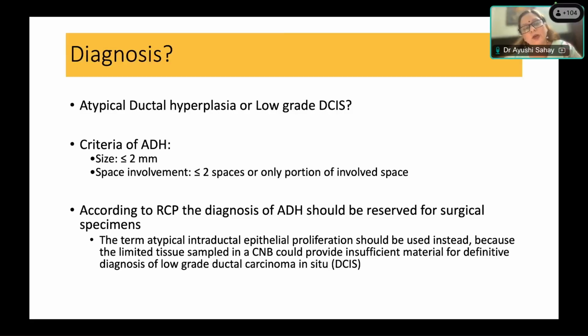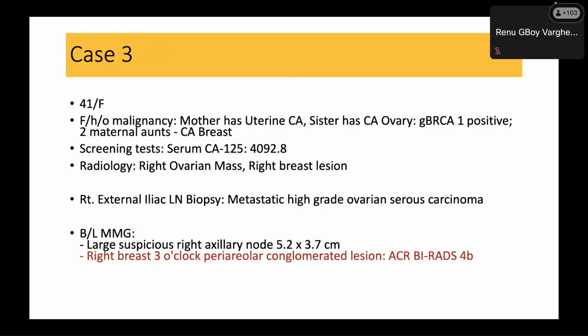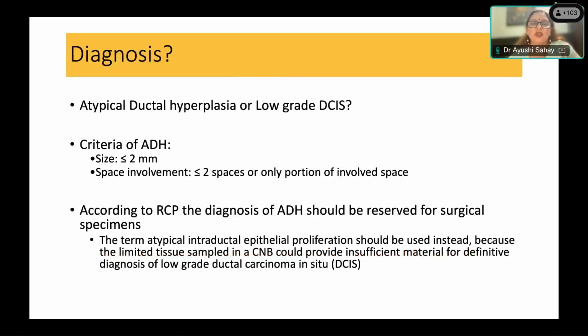where you can see that a proper fibrous capsule was there. So that is why in this particular case it was given. But in general, even if you give papillary carcinoma and advise excision to rule out invasion, that is also perfectly fine. The important thing is to advise excision to rule out invasion, because sometimes you are not able to pick up the invasive component on the core, as I showed, that you can have invasion beyond the walls of the capsule, which you might not be able to pick out on the core.